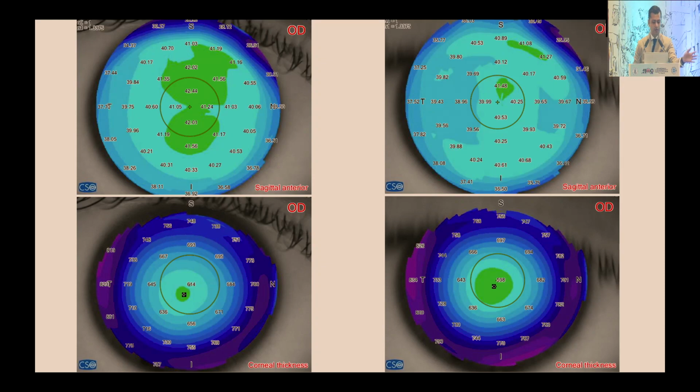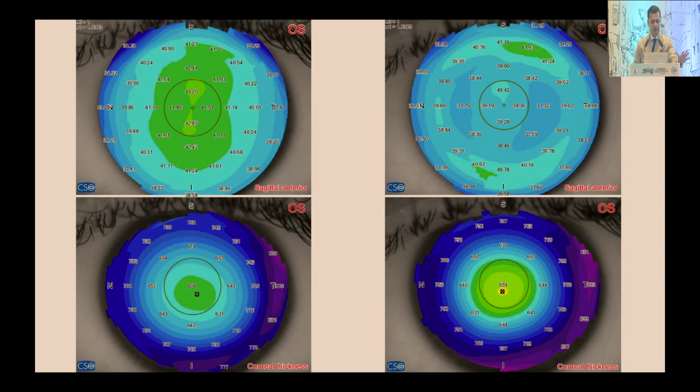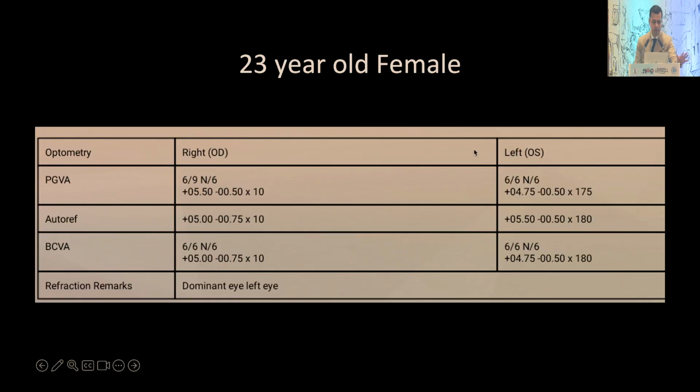And this is to show you a before, and this is to show you after of the same patient. It's a very pristine cornea, very well balanced. The entire ablation profile is centered onto the pupil, and it's a very, very clear situation. That was a myopic LASIK.